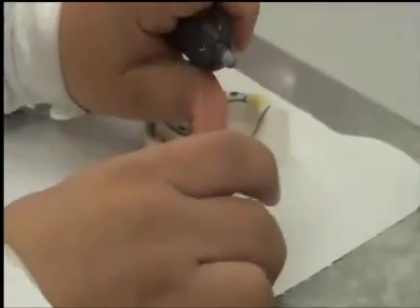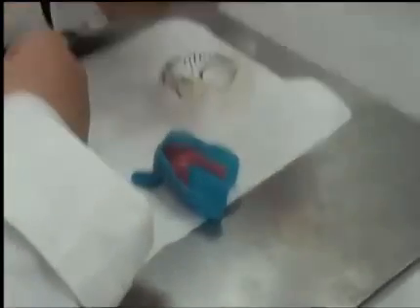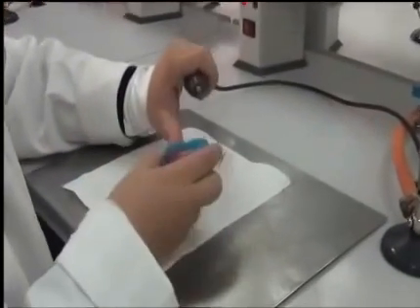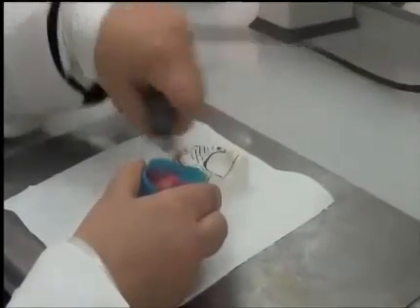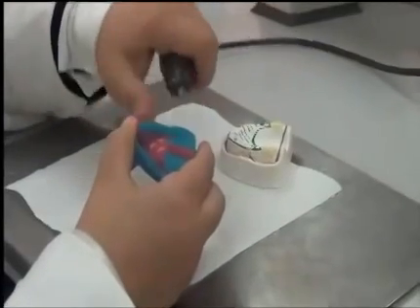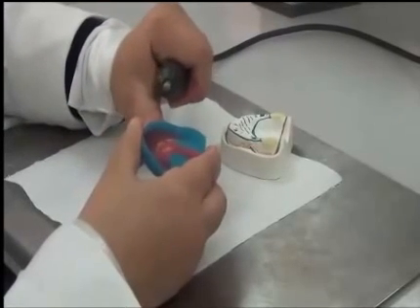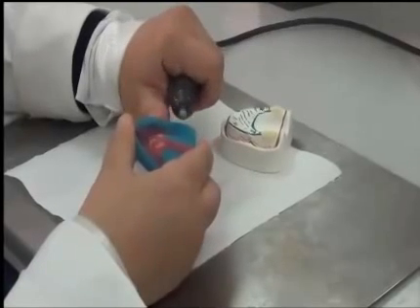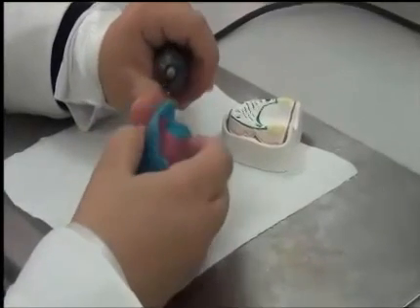I would also like to note that I'm holding with what's called a safety grip. I hold the handpiece with 4 fingers, and I leave my thumb out to press on this material that I'm trimming. If I don't have this hand rest and I'm working like this, it might slip away and traumatize me. It's not safe. Sometimes you're pressing so much and it simply slips away. So we need to make sure this slippage, if it occurs, is controlled. So we put a finger rest here and we work. Even if this slips away, my finger is preventing further movement. So we need to work with the cast.